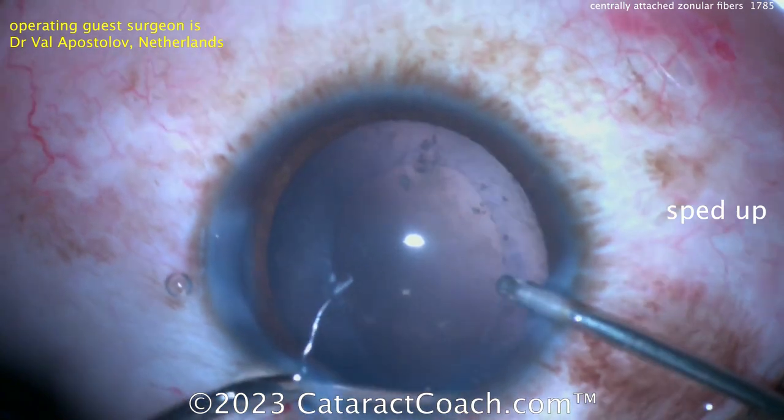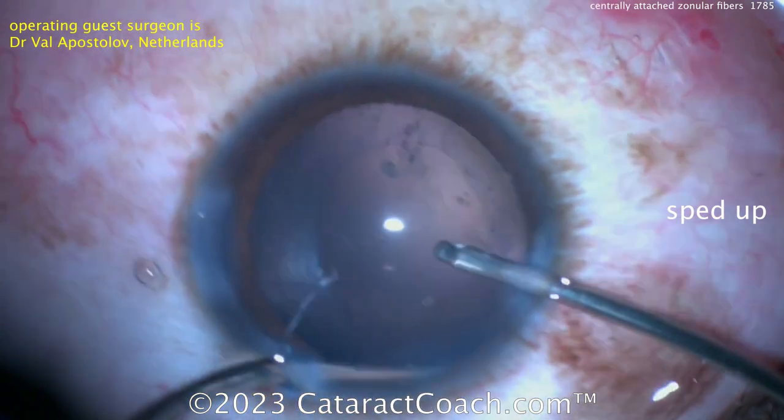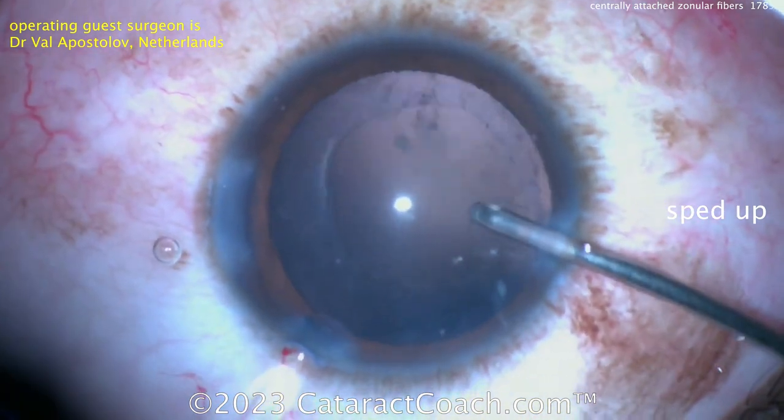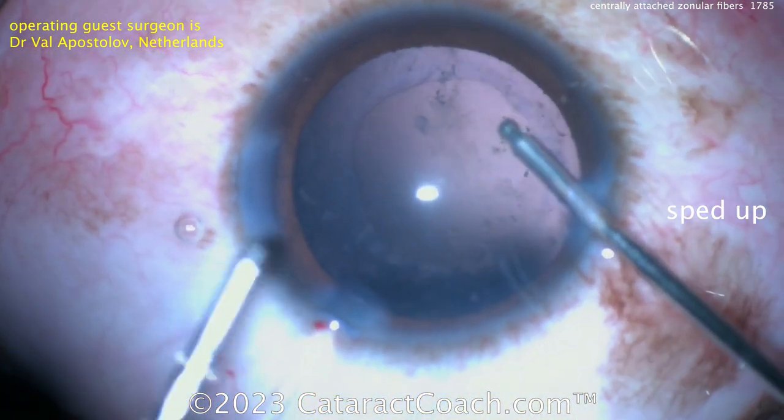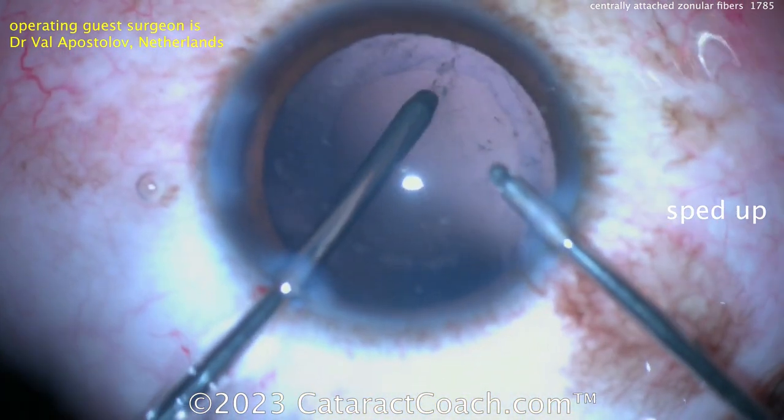I've not seen a whole lot of cases where the zonular fibers are attached that centrally onto the anterior lens capsule. Usually it's way out near the equator, or maybe a millimeter or two in, but to come this far in is unusual. But that's the beauty of what we do — the variations in human anatomy. No two cataract cases are ever the same; they're all a little bit different.